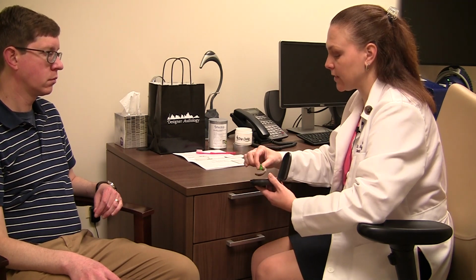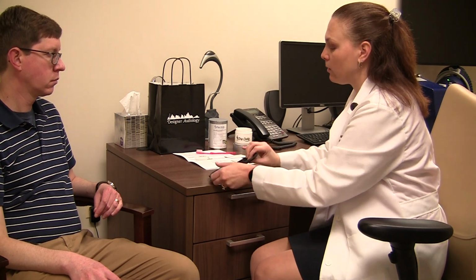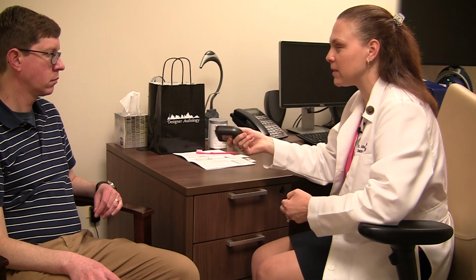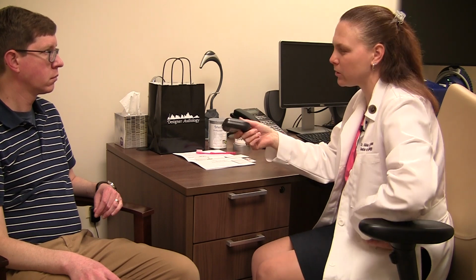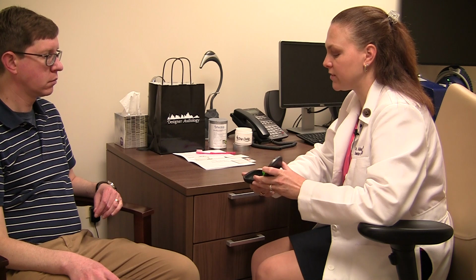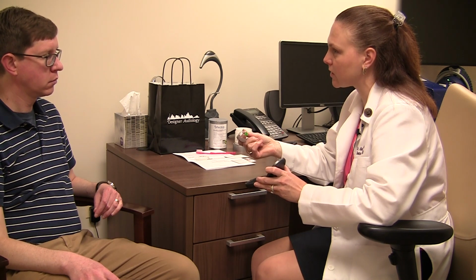So if you're not using them, crack the battery door to turn it off. And both of them will fit in here comfortably and you can close the lid. This keeps them safe from the dog, keeps them from being thrown away so they're not in any Kleenexes, and it keeps them safe so you don't put them in your pocket and put it through the wash. When you're ready to use them again, all you have to do is open it up, turn the hearing aid back on, and you're ready to go.